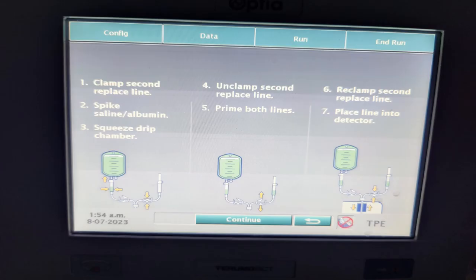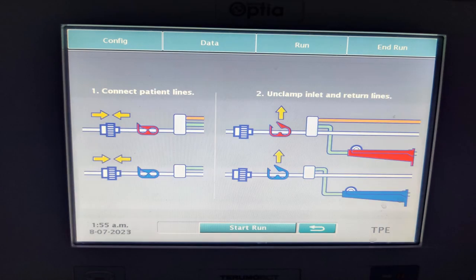Once the custom prime is done, like any other plasma exchange procedure, we are supposed to hang the replacement fluid. Following that, we connect the lines to the patient and start the procedure.